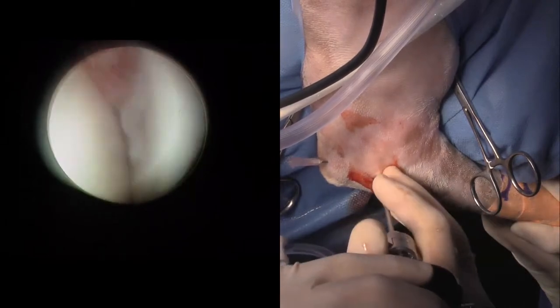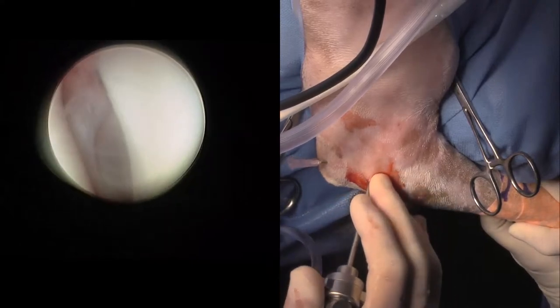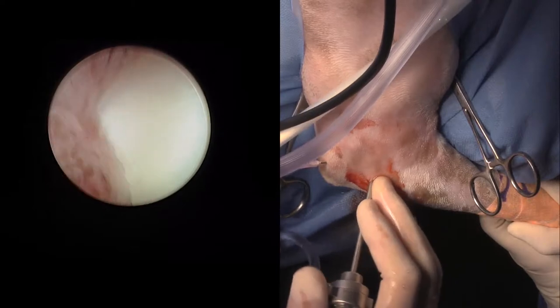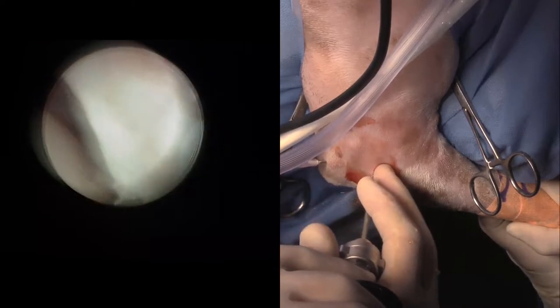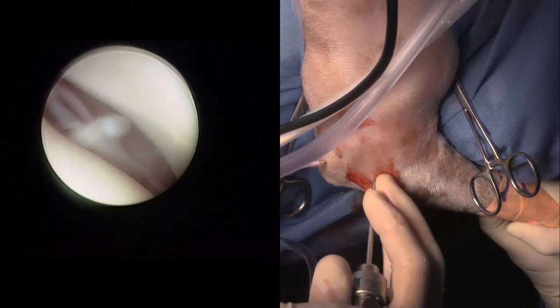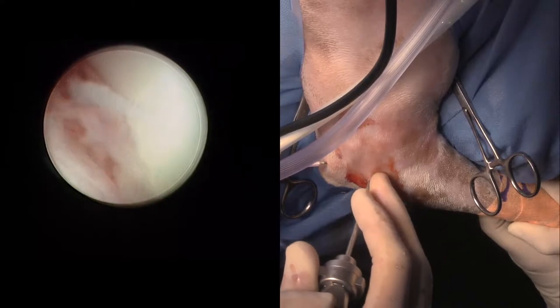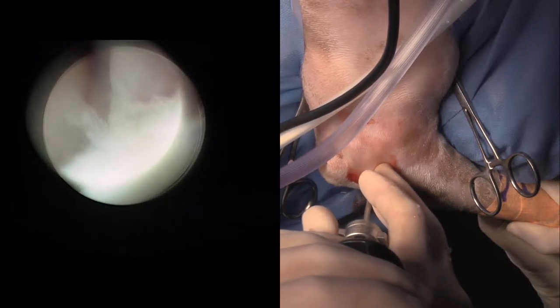So I'm looking cranially. So that's the coronoid right there. That's the semilunar notch. That's all synovial proliferation. I'm looking back along the semilunar notch there. That's my egress needle.